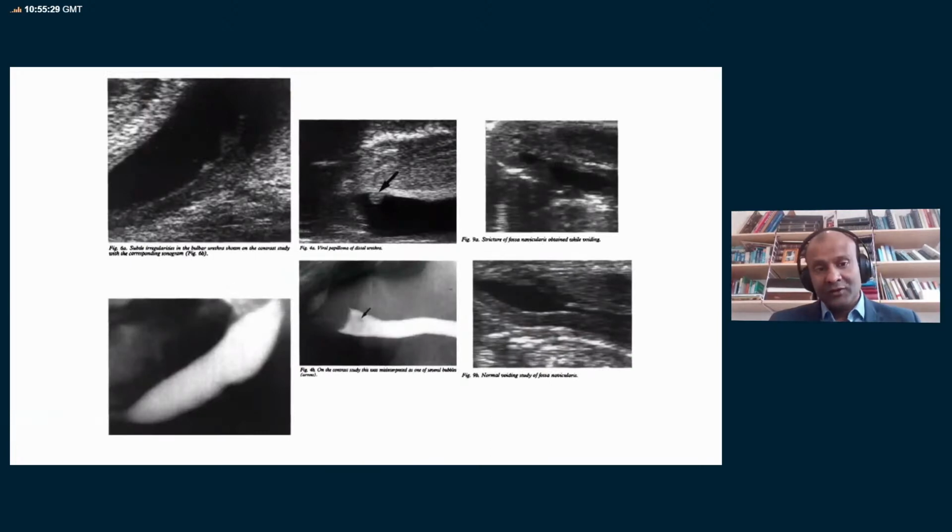And here, again, ultrasound is starting to get better now. The pictures are starting to get clearer. And you can see clear images. And here are some images in their description where actually in the bottom there, the urethrogram looks pretty normal on the left and in the center. But actually, if you look on the ultrasound, you can pick up abnormalities within the urethral wall.